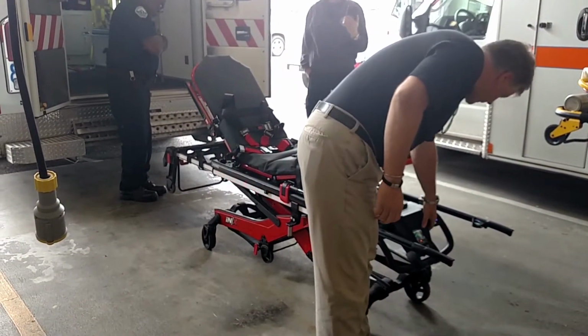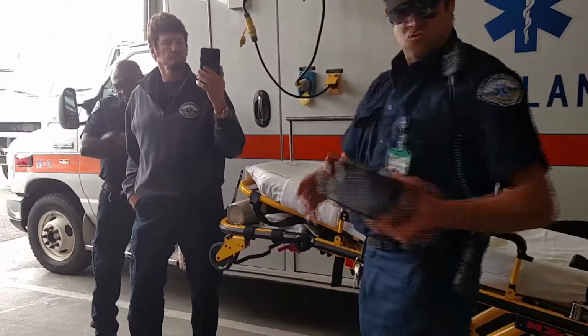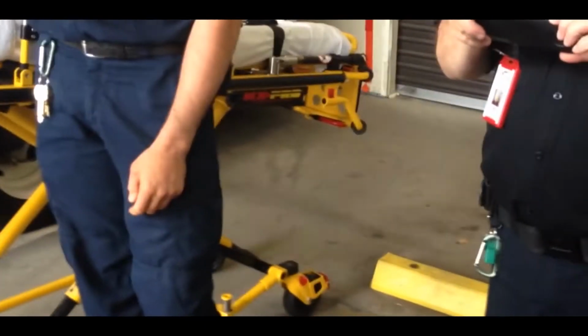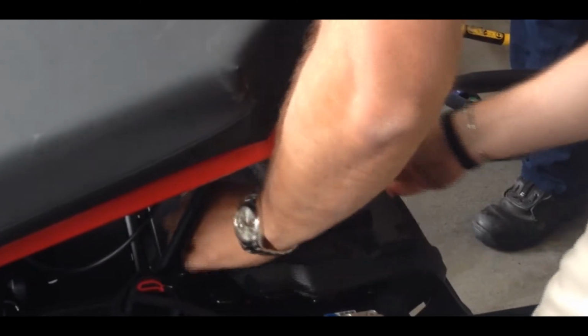If you did need to swap the battery out, the battery lives right here. Take it out. Oh, boom. Lithium ion, yeah. Oh, dang, extremely light. So you can just carry a spare inside of it. You could, yeah. It's unbelievable. The lithium ion, like I said, there's no memory issue, so you can partially charge. It's not going to falsely tell you. That's a mini little fusion reactor. I like the idea. And it's an idiot-proof connector, correct? Yeah. Continuously charge while you're moving.